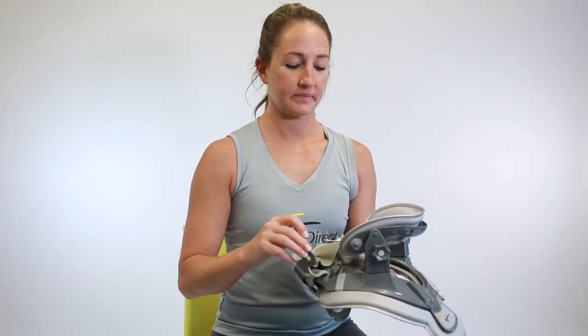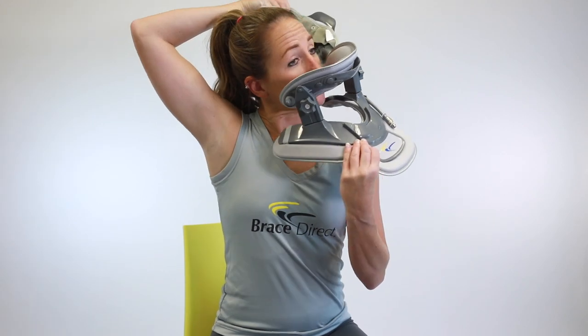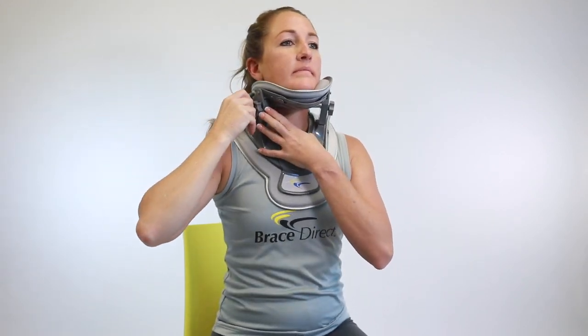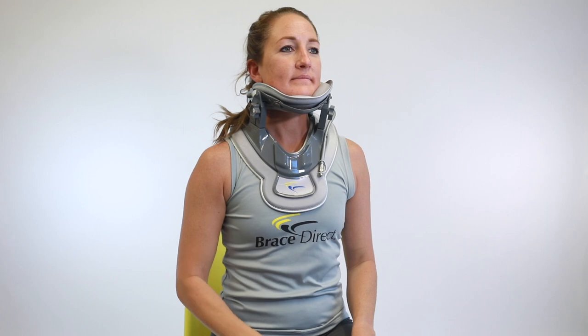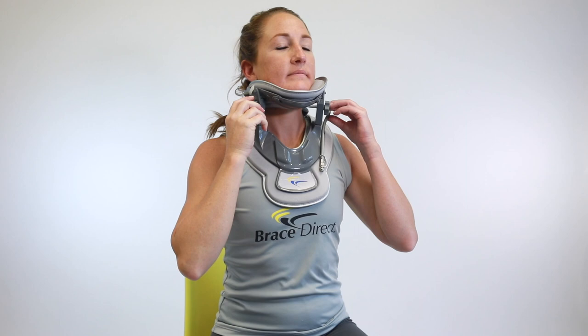Release the pull tab pin and open the collar. Insert the head with the chin slightly raised and centered. Fix the pull tab to the knob to secure the collar. Turn the back knob clockwise to your comfort level.